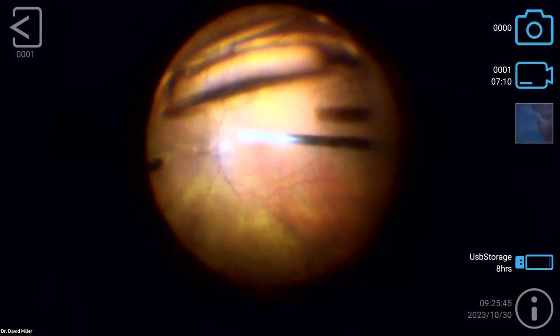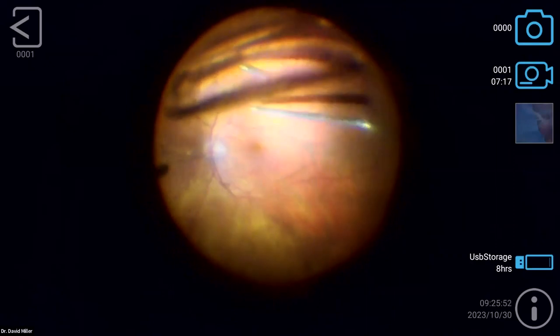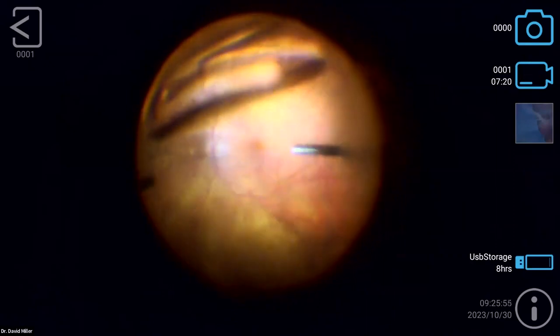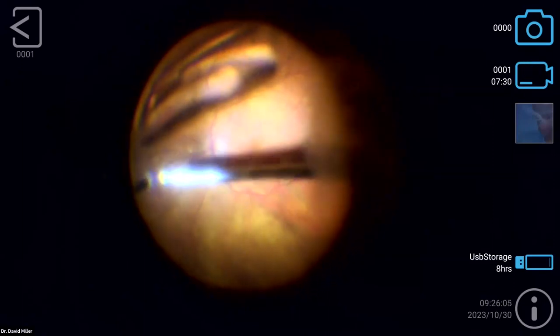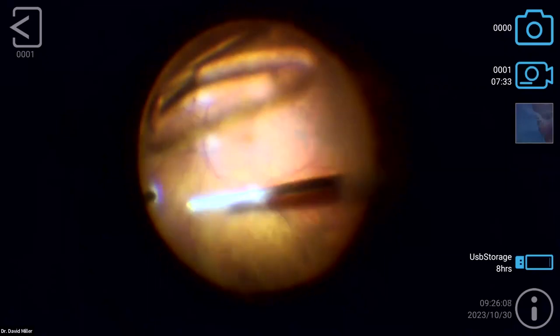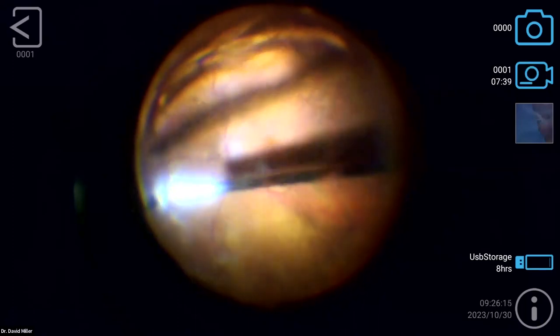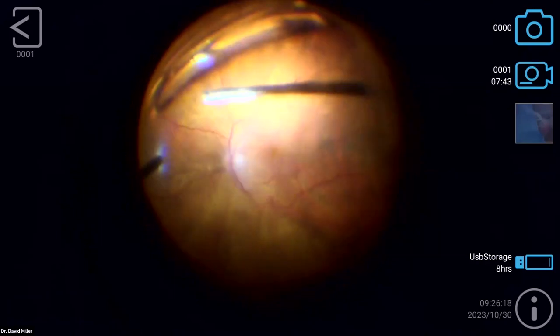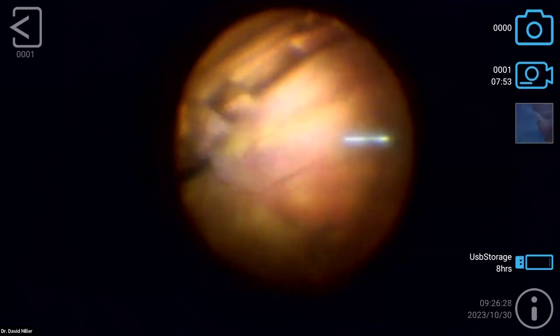You can maybe just start to see the shadow coming up there. This is a tougher view, I think, for the camera. You can see the shadow of the vitreous there, and it's dripping out quite nicely. And there you can see the Weiss ring came up. The advantage there is now I know I got the vitreous that's not going to get snarled up in sutures or lens removal or a lens insertion and tying, etc. So I just feel much more comfortable in an eye that has what I call a complete vitrectomy. And you can see the lens implant shaking and moving again because of those vitreous attachments. That's why you don't want to just grab it and pull it.